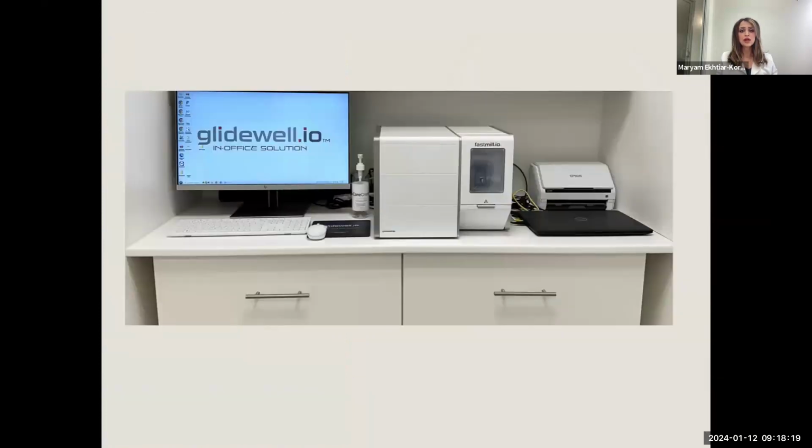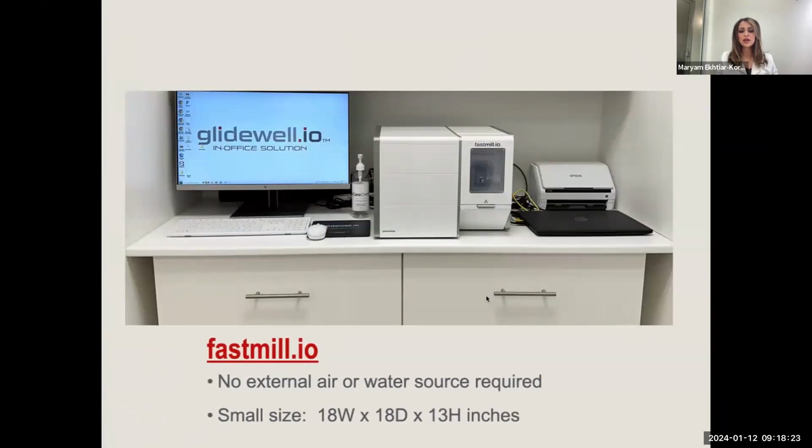This is a close-up of the area where I have my fast mill. And as you can see, the fast mill doesn't have any external water source. And it's relatively small compared to the monitor.